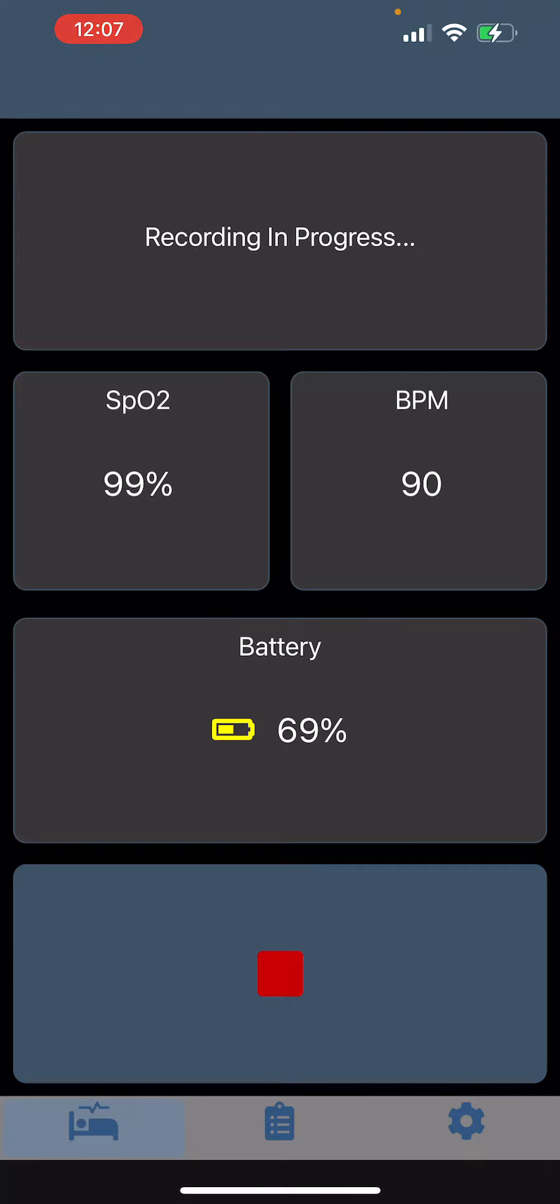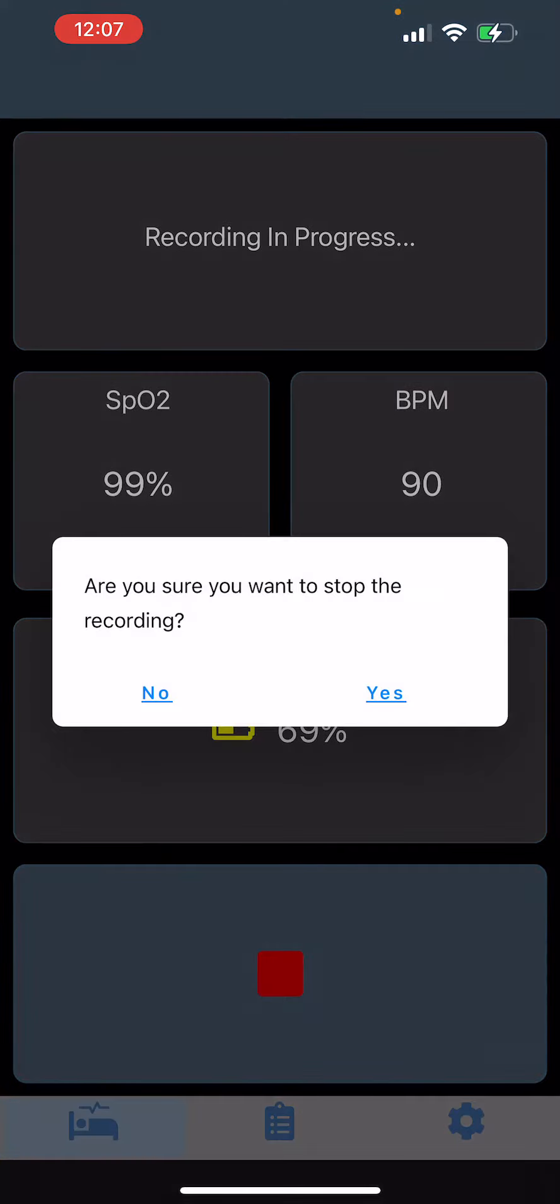Once you wake up, go ahead and stop this. It will ask 'would you like to stop the recording?' - click yes.